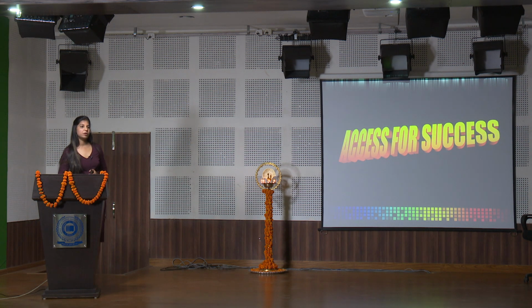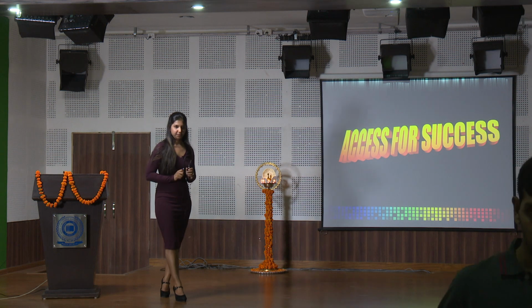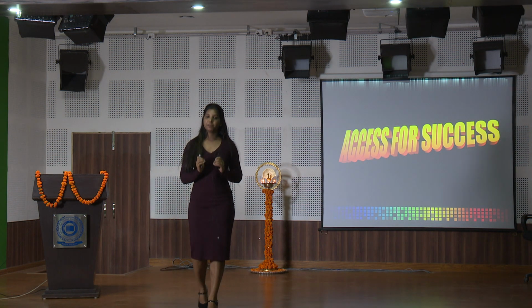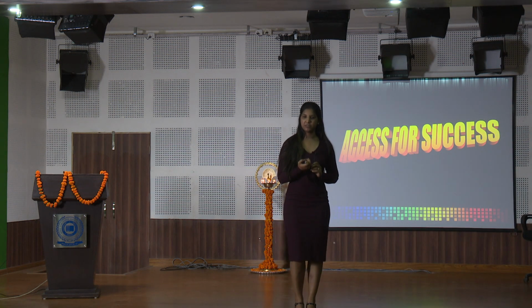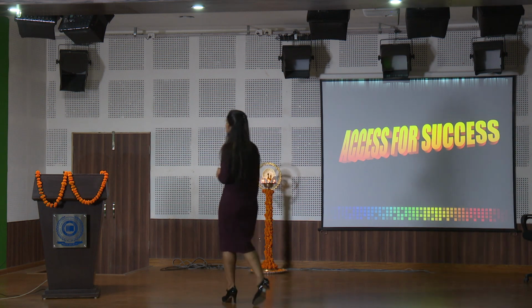To begin with, we talk about access. We all have read this, that access is success. Access being the most important and the first step in endodontic treatment has to be done very carefully. It has to be given the maximum time in your endodontic treatment so that the rest of the root canal becomes very easy. Once you have a good access, your irrigation, shaping, cleaning and obturation will be done in no time. In my practice, I spend most of the time doing a good access, and then everything else is a cakewalk, believe me.